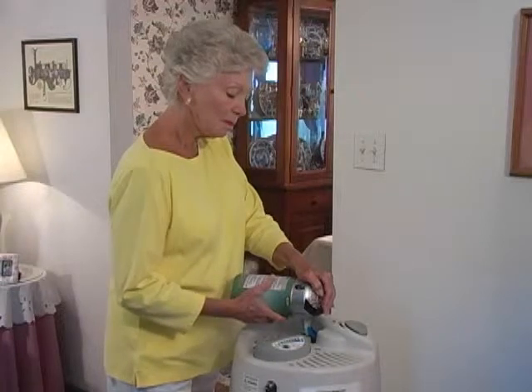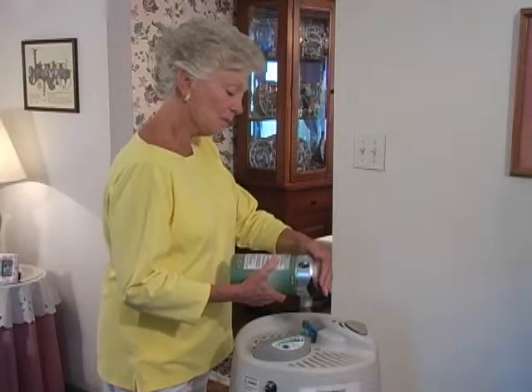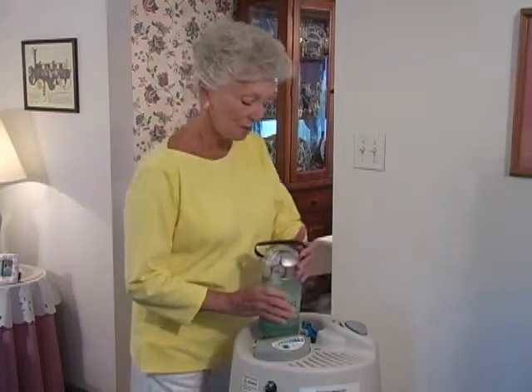Release the vent to fill lever to stop the flow of liquid oxygen. Pull straight up on the portable to release it from the reservoir, and it's ready to go.